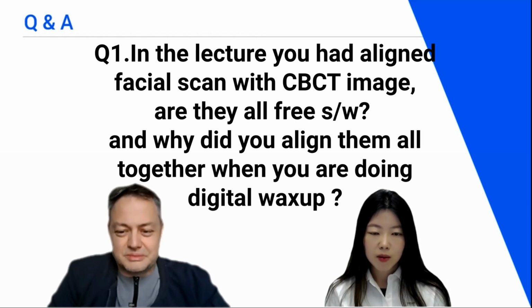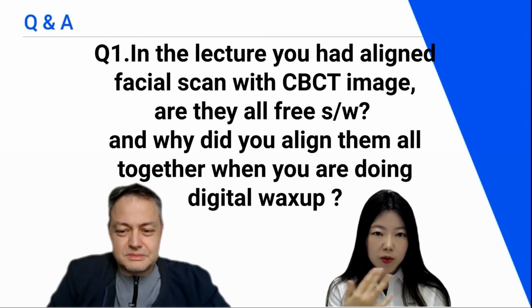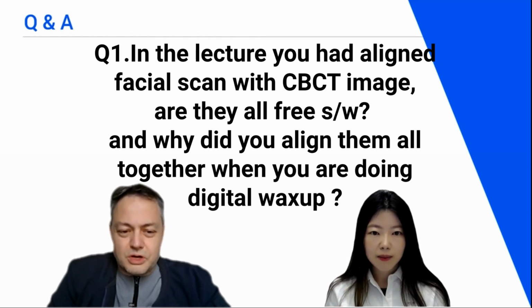But in your lecture, the case was just for the full mouth rehabilitation, or ortho, or what was it about? No, ortho was not planned in this case, but merging the actual crowns with the roots is very helpful for orthodontists as well. So it's a technique that you can use on any case you need when it goes to ortho, for example, for aligners.